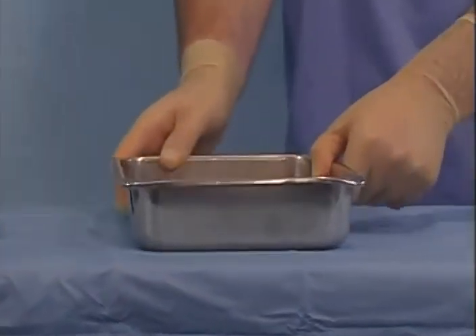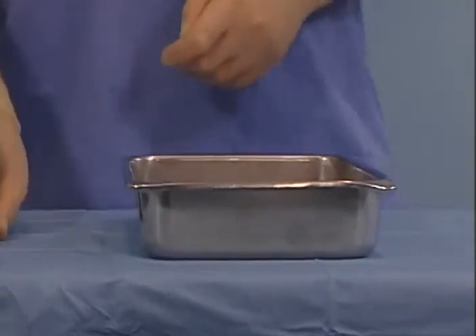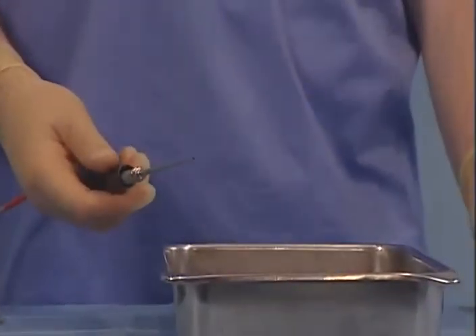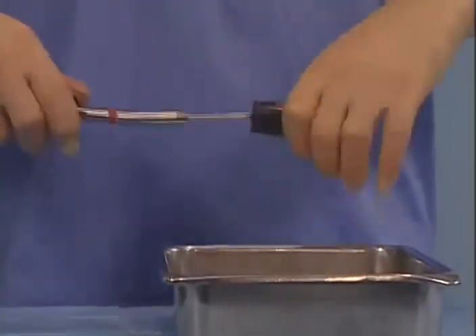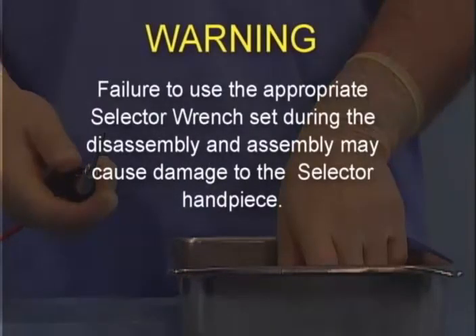To clean the handpiece, prepare a cleaning solution of warm water containing detergent in a sink or bowl. Remove and discard the clear flue. Remove the black shroud and place it in the cleaning solution. Warning: failure to use the appropriate selector wrench set during disassembly and assembly may cause damage to the selector handpiece.